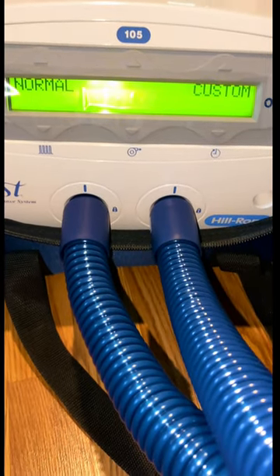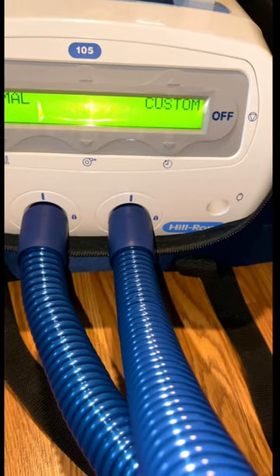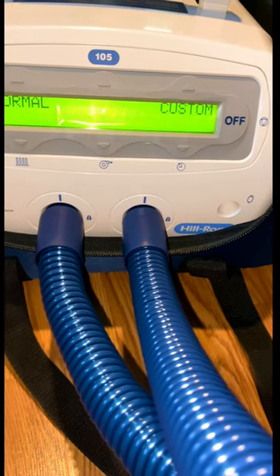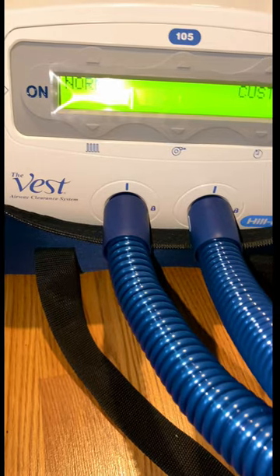Today all I have to do is hit the normal mode because it's set up for him already. They have arrows right above that custom and that normal. What I've already done was hit that arrow right above the normal, and what that does — as you can see my beautiful son, my namesake Trevon — is it inflates right in there, that white portion inside the vest.